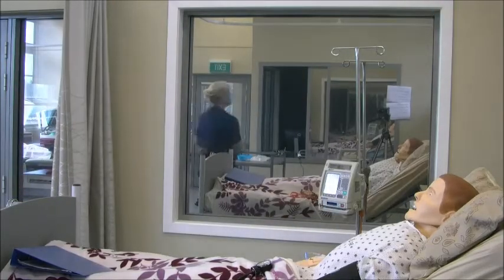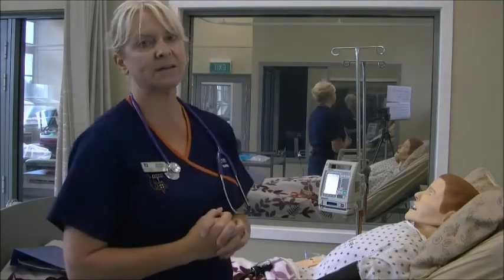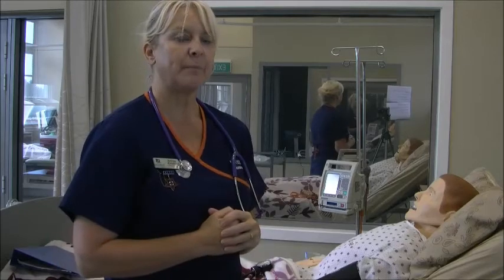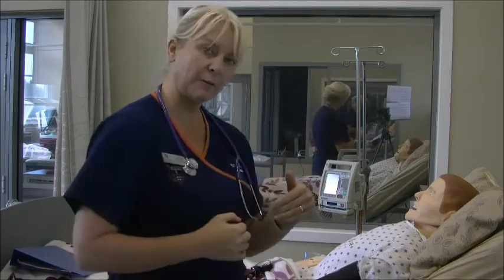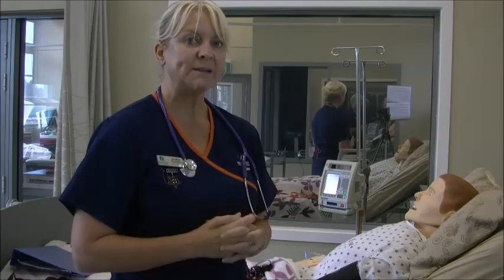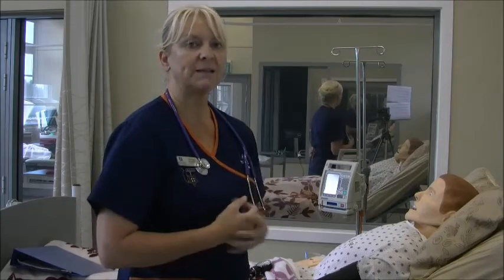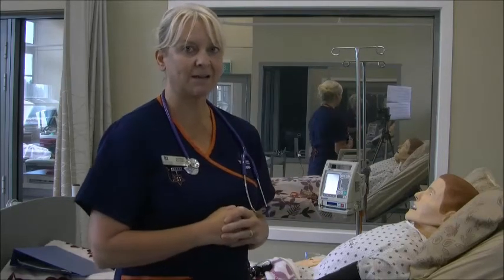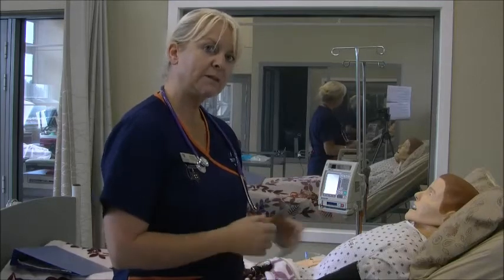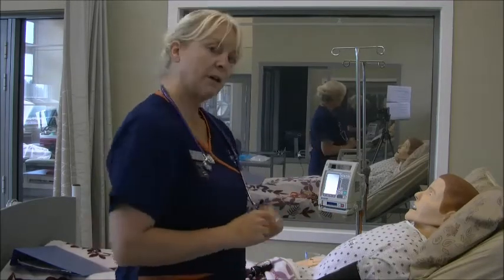For this assessment, I was asked to do a cardiovascular assessment and a neurovascular assessment. So I might do those, I've done part of them, but I might finish those after I've put the IV fluid up. The reason I'm going to do that is because he's come into the ED for treatment and he needs the IV fluids, so I think it's a good idea to get those started because I feel he's quite safe at the moment, and he needs the IV fluids. So I'm going to go and collect those.